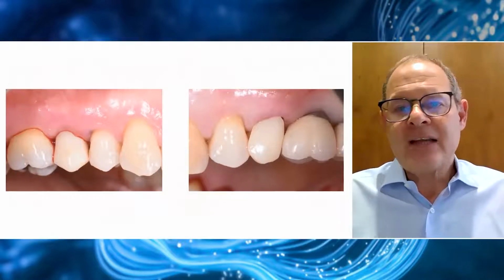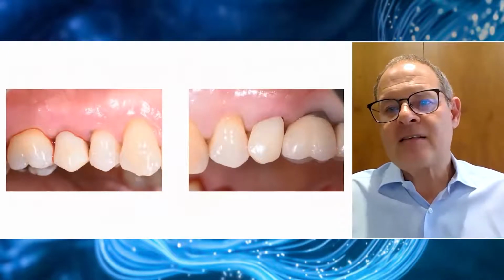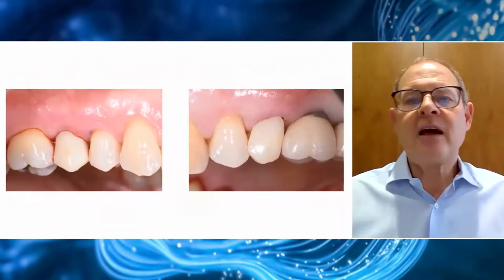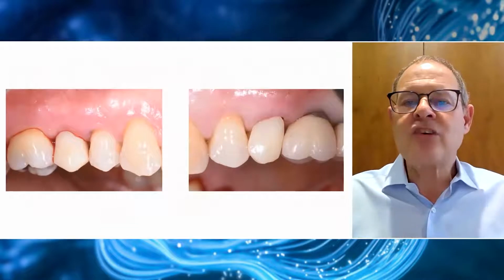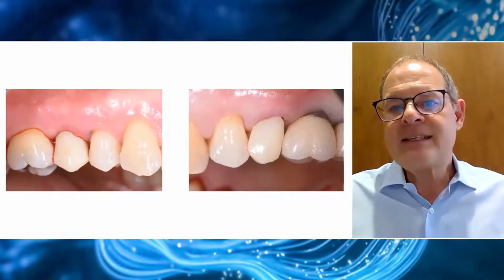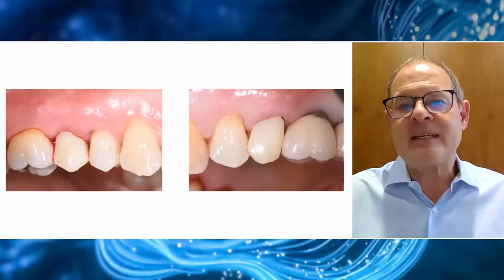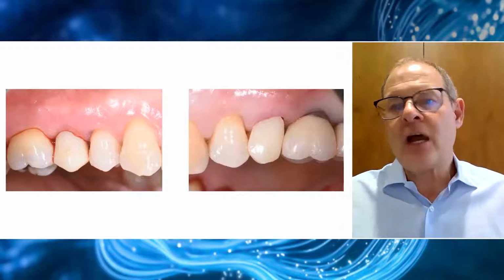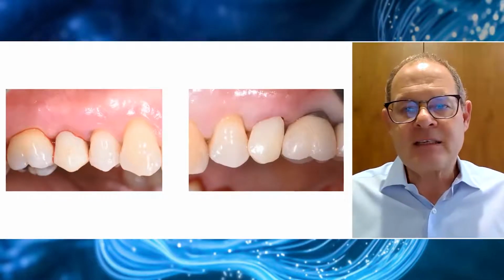And in fact, as you can see on the distal cervical margin of the upper left premolar, we can adjust the contour. So I've actually under contoured that crown. You see a small gap to the gingival margin. And this is to encourage the soft tissue to come down a bit there to give me a better scalloped architecture and perhaps a more defined distal papilla there.